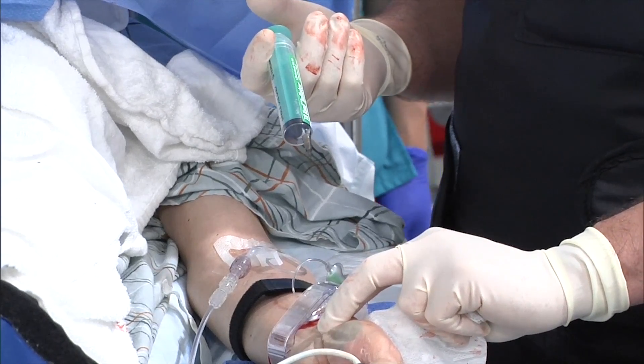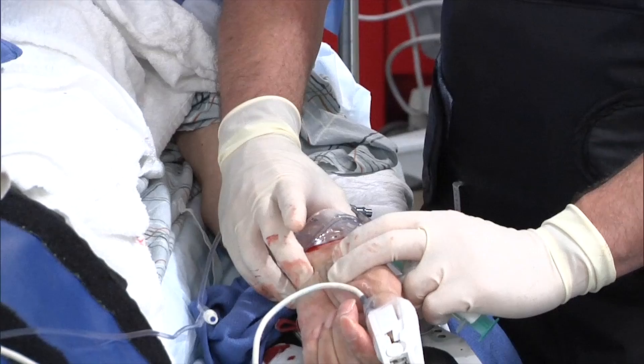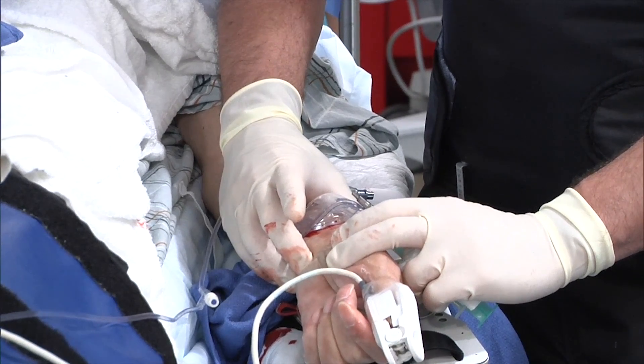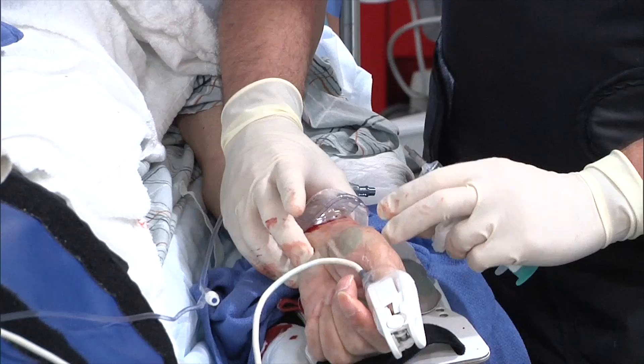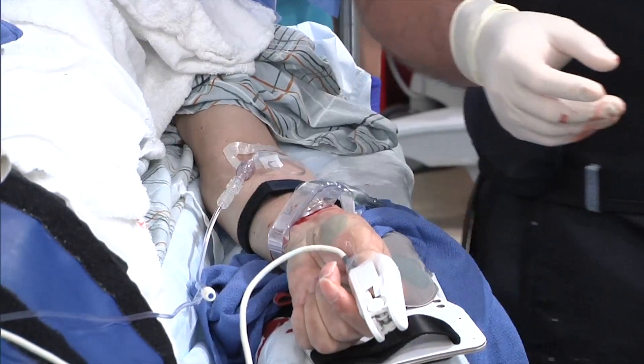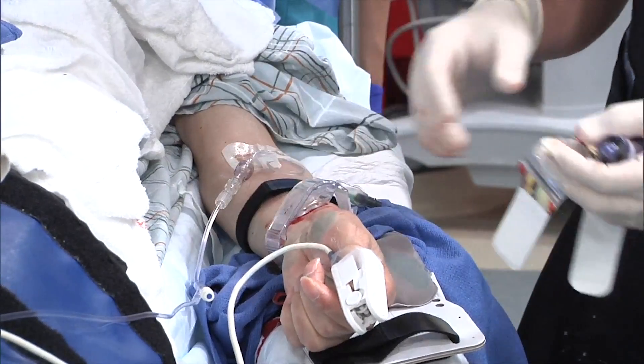There's a great distal radial pulse, which is one way to do it. The other way is to occlude the ulnar and watch the monitor and see if the radial pulse is still there, which it is — you guys can hear it on the monitor. So that's the other way to demonstrate that you have patent hemostasis. You can see here there's no bleeding. It's perfect. The artery's open and we're good to go. I'll leave this on for about an hour and then I'll take it off.